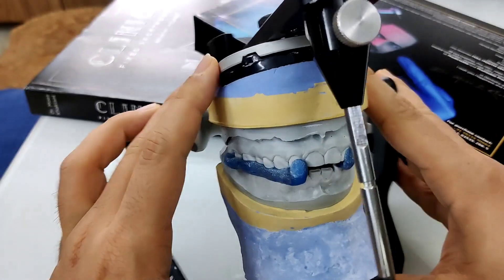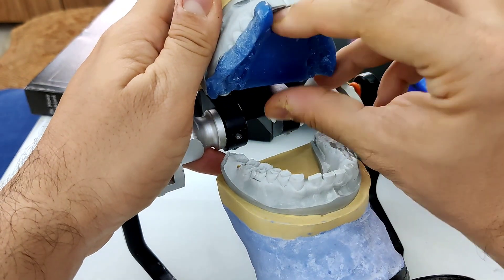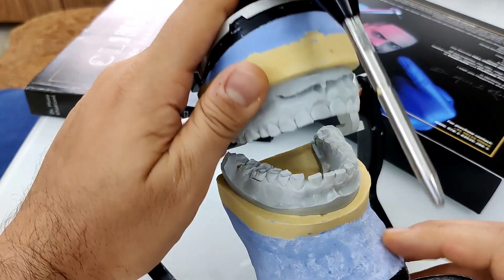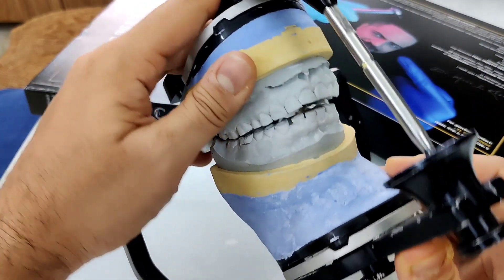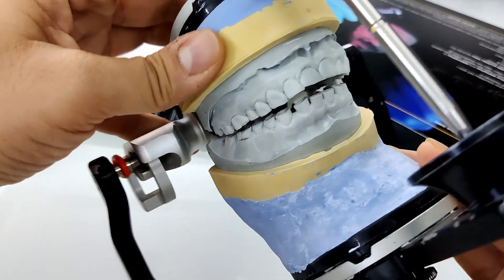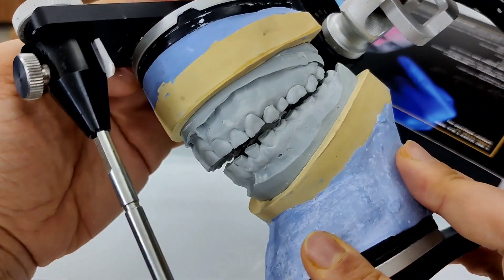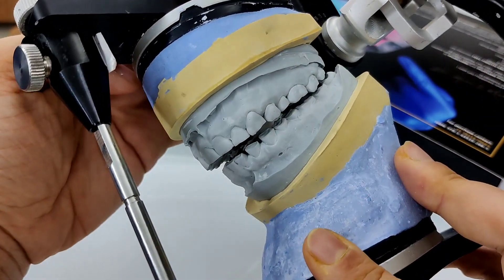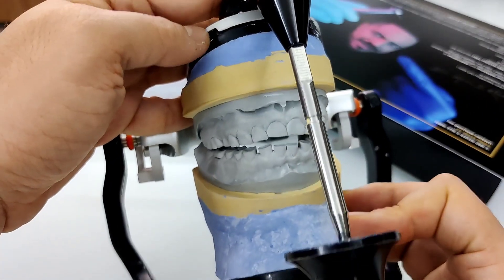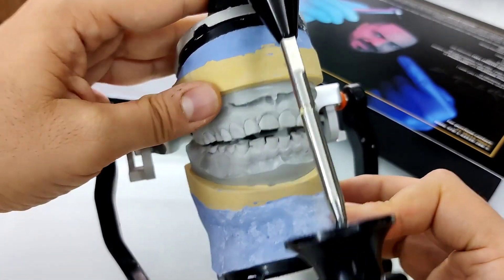I'm going to go ahead and open up and remove this CR record, and as I close down, you will realize that none of the teeth contact each other. This is because the CR record was made at an increased vertical dimension, and that is why there's a gap between all the teeth.